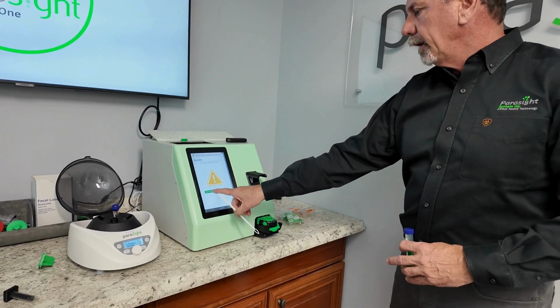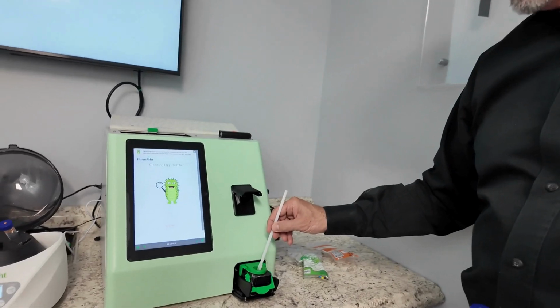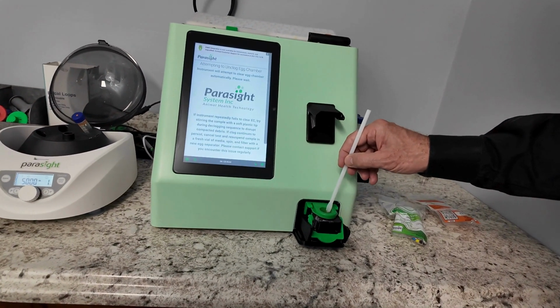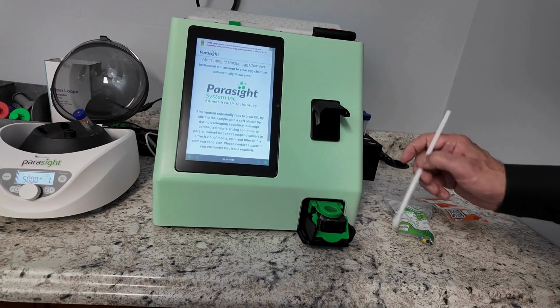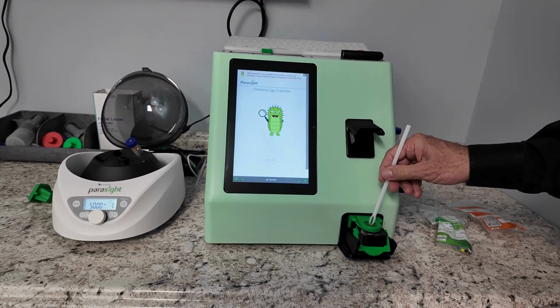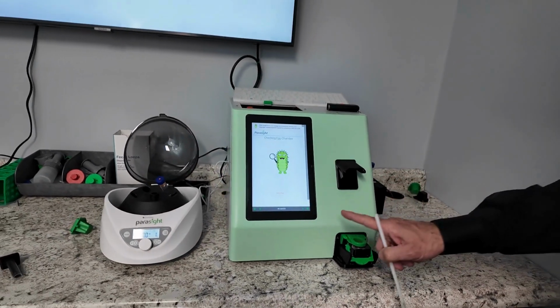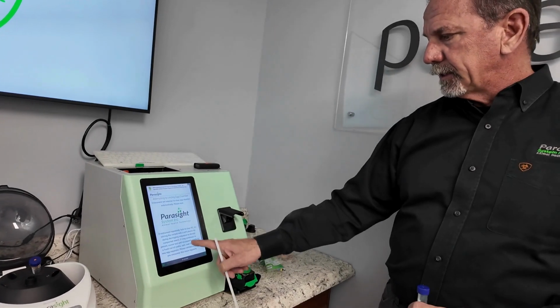So here you'll hear the machine trying to pull that through. And what I'm going to do is gently stir as it's trying to pour through there and see if it will unclog that. You'll see that there are directions on the machine to follow for that. But in this case, even though I'm trying to stir, it's not unclogging. If this occurs, what you want to do is cancel the test.